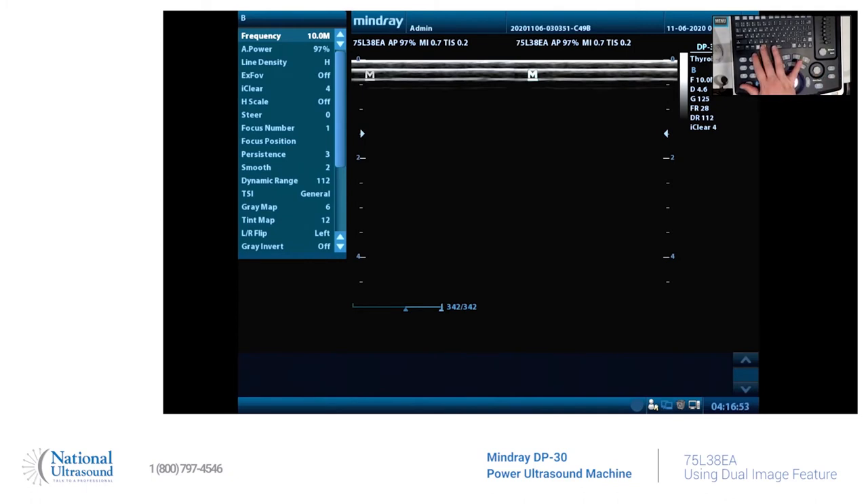You toggle between the right and left dual screen by just hitting dual. The one that is lit up with the brighter indicator is the image being depicted at that time. You can hit freeze or hit dual to switch to the next one.